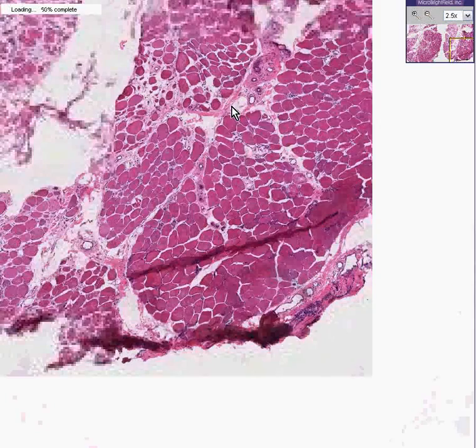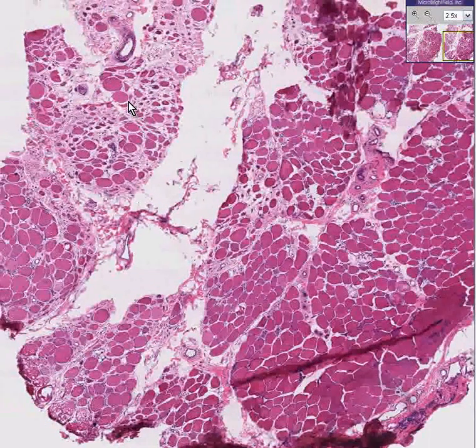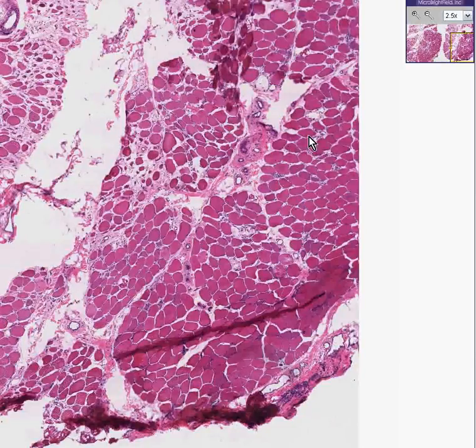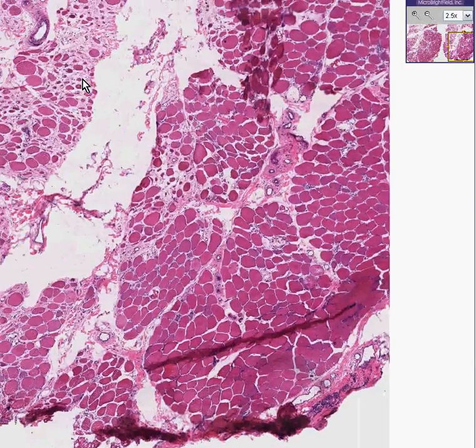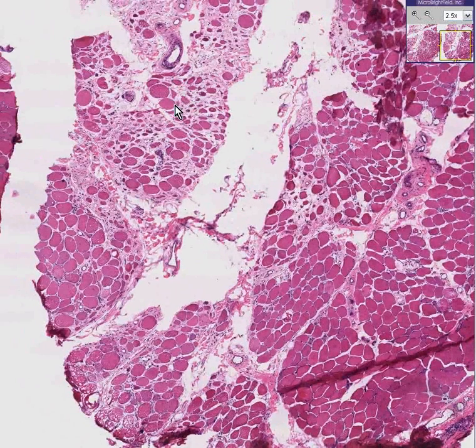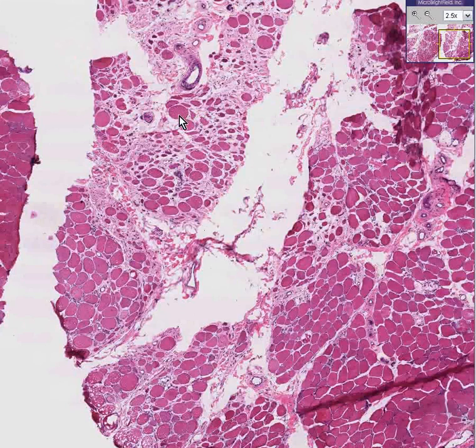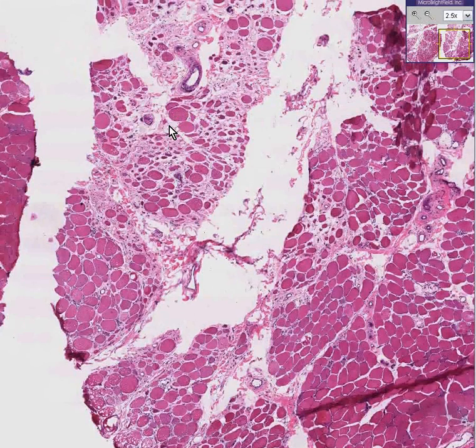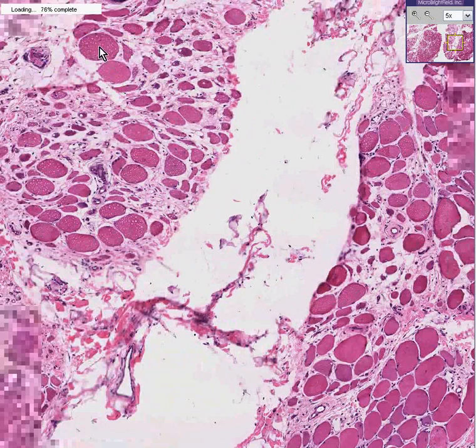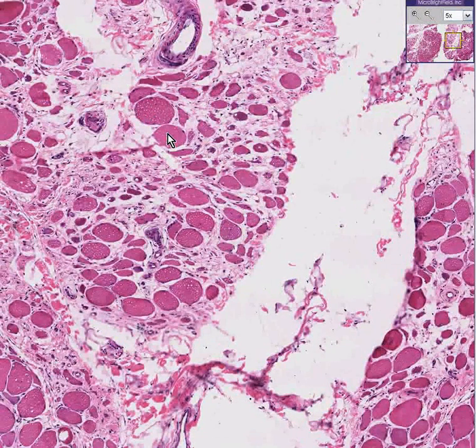Let's look at some of the fibers that show hypertrophy. If this is the general fairly uniform size of a fiber, and many of the fibers in this area are dropped out, I could convince you that here, and here, and probably a few of these, there is compensatory muscle fiber hypertrophy — some of these fibers are bigger than they should be.